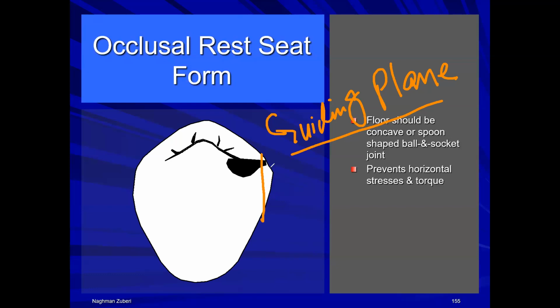At times you have to prepare to avoid the undercut. Just remember that this upper area is called the suprabulge area. This is the maximum bulge area, and this is the infrabulge area or the undercut area. So to avoid that undercut, we have to prepare the tooth with a straight bur. And we do it after the designing of the denture using the mechanical surveyor and all the necessary procedures we do for the designing of the denture. Just giving you a brief idea.